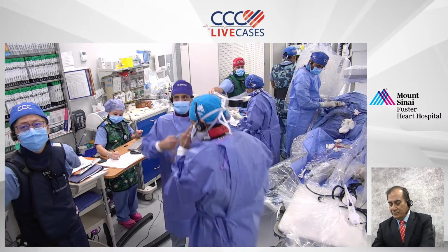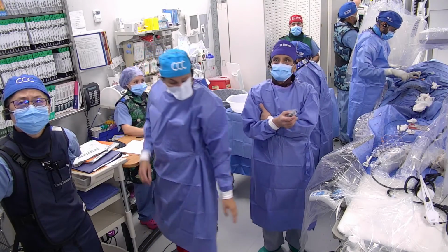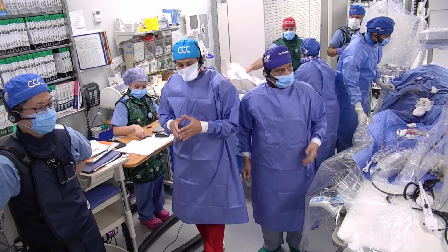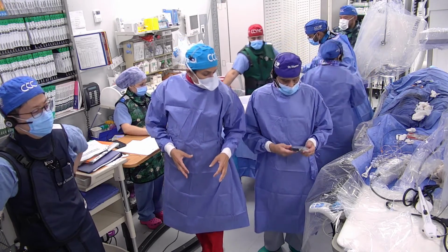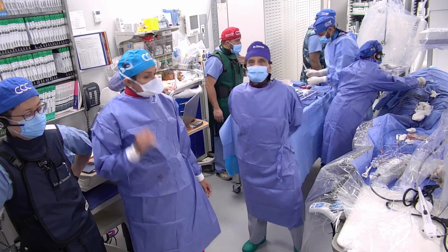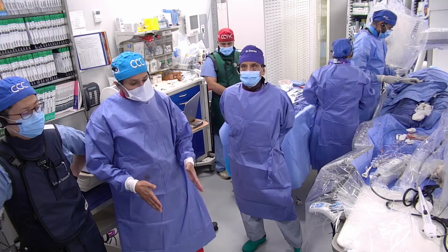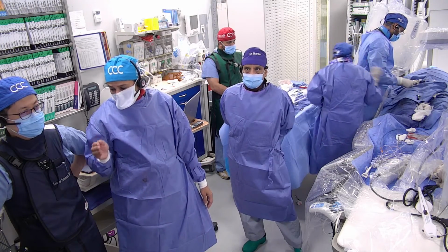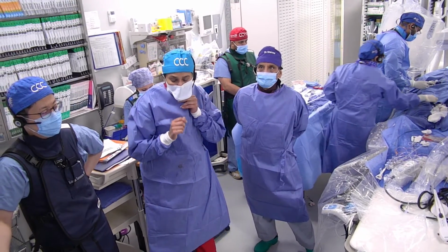What I was trying to teach is that since imaging guidance is becoming standard, and the guideline changes will show it, people have to know what we are understanding from imaging. The final verdict is stent optimization and the best result of the stent. When you see that you met those parameters, and when you see other things like dissection, you need to know what to do.